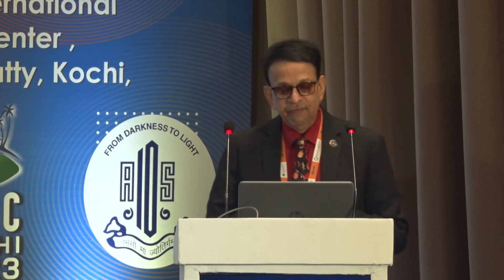In chopping technique, I use the karate chop or the anterior chop, using the cold phaco technology, which is available in all the micro pulse or the hyper pulse. If you are going to use the Ozil on the Alcon Centurion and Infinity machines, or the Ellips on the Signature, the J&J machine as well, the Signature Pro machine, you can see how easy it is for you to go ahead.